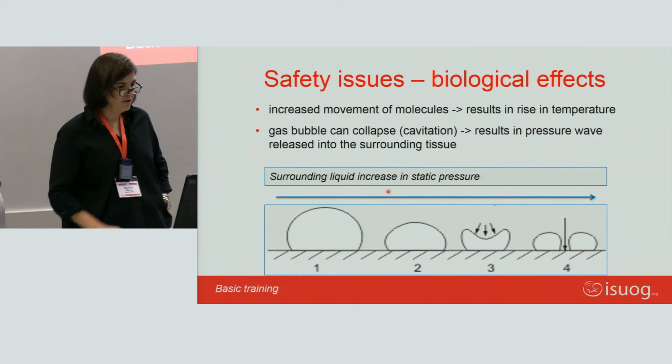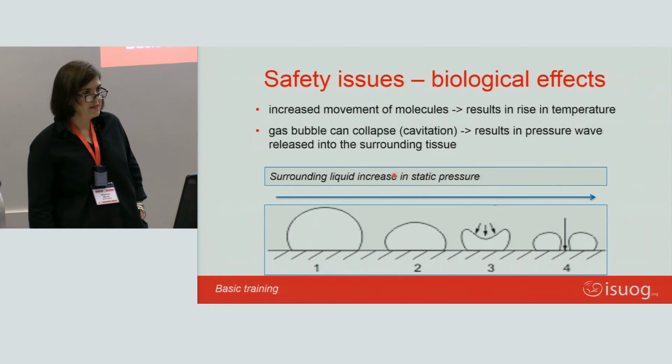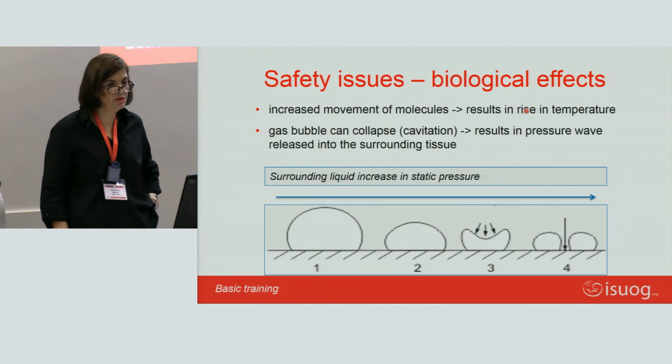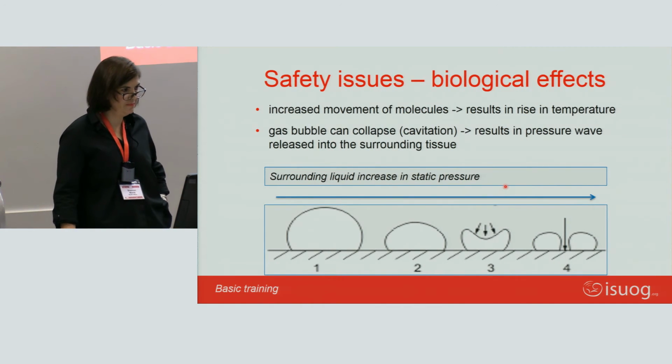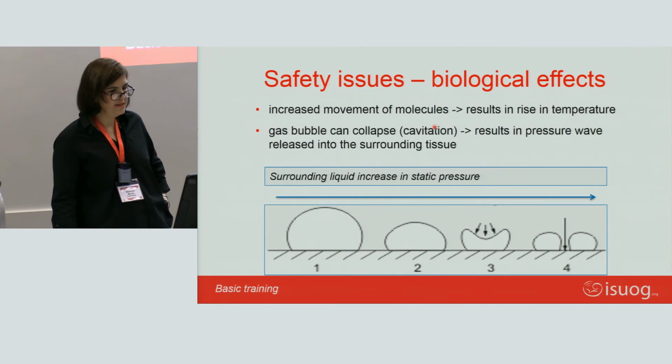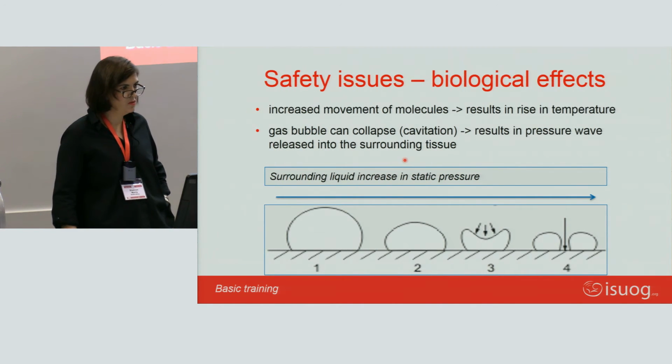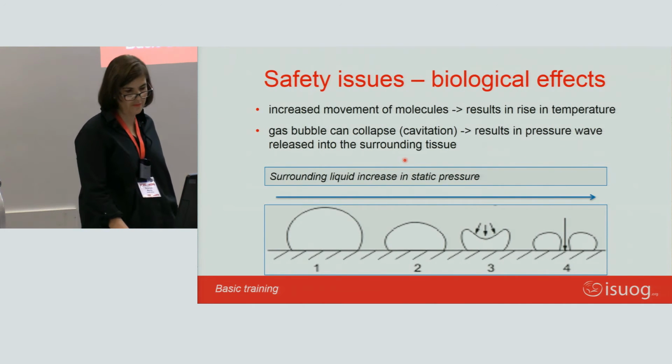The last part of my talk is something about the safety aspects of ultrasound. We know ultrasound is safe, but with the movement of molecules, you get a rise in temperature, and you are heating the tissue. And when ultrasound beams hit a gas bubble, it causes collapse or cavitation with a shock wave and the creation of more warmth.